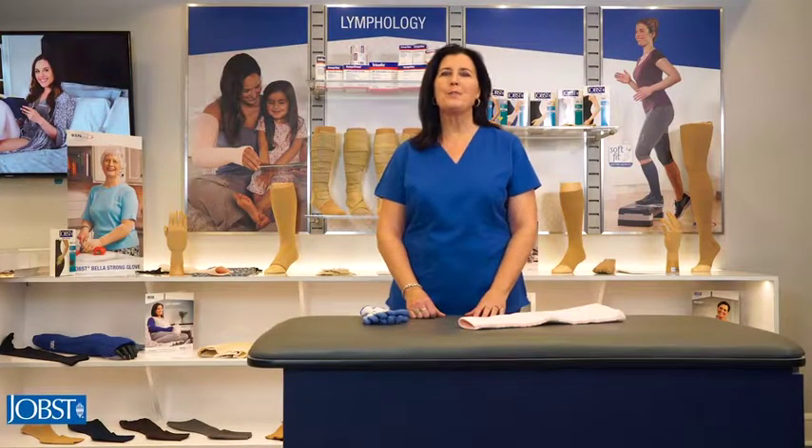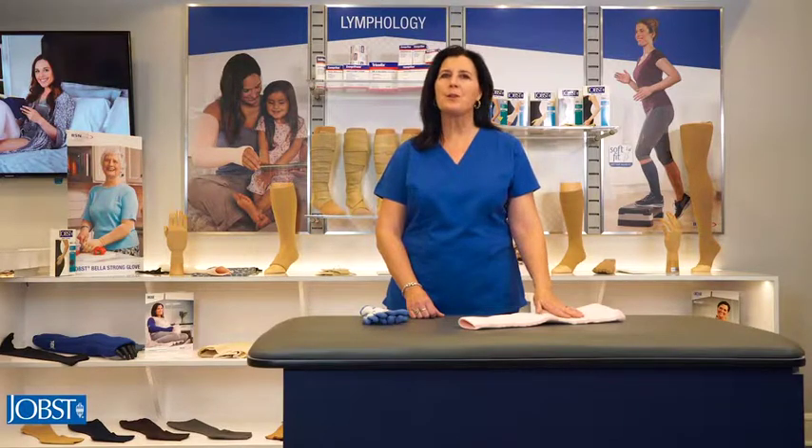Hello and welcome to the JOBST Compression Institute. My name is Margie and I'll be your host for today's session. In this presentation we're going through the proper donning and doffing techniques to use with your JOBST Relax garment. Like most compression garments, pulling on the fabric is one of the main contributing factors to the garment breaking down. Over time this pulling will compromise the fit and ultimately the compression of the product. Therefore we'll be going through the recommended techniques to ensure you get the full therapeutic benefit and lifespan out of your JOBST Relax garment.